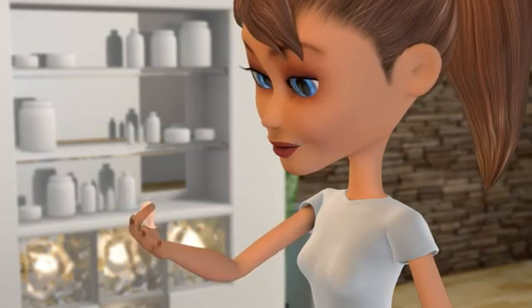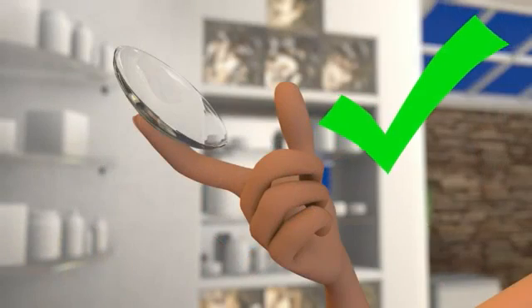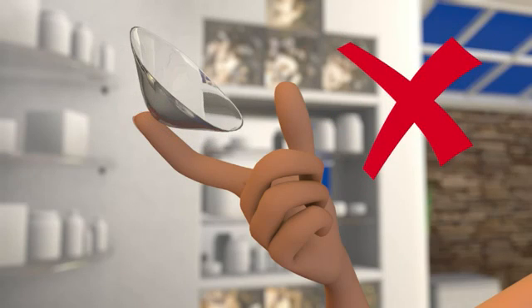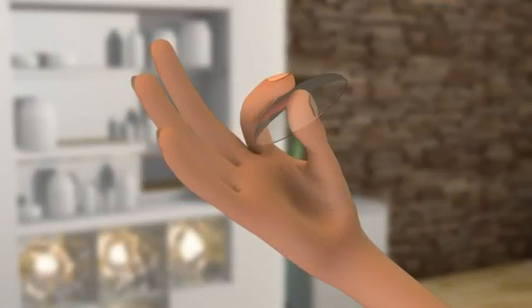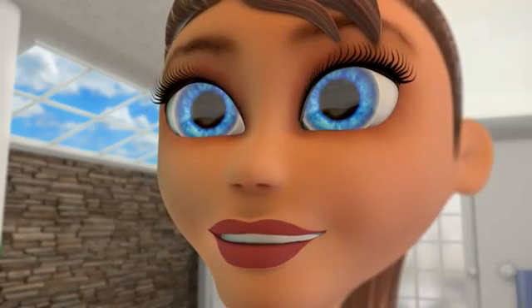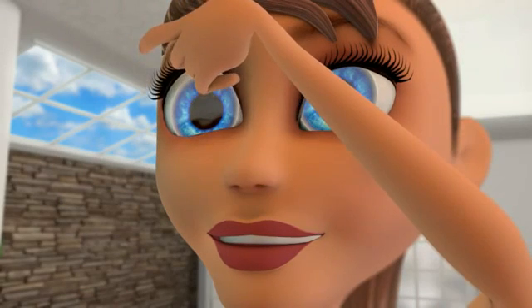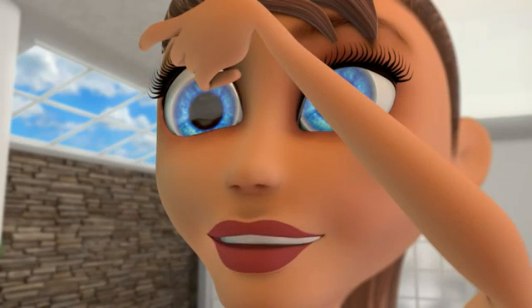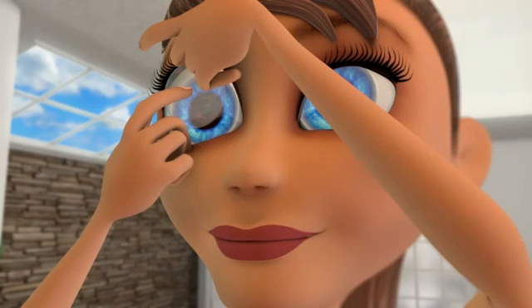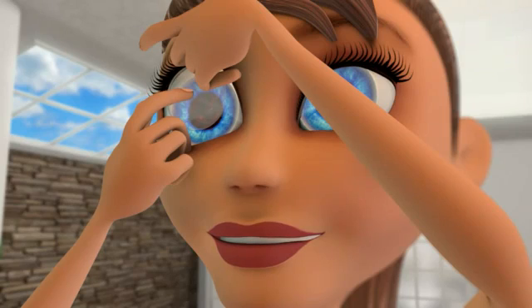Then, verify that the contact lens isn't inside out. There are two ways to determine if the lens is inside out: if the edges of the lens turn out, or if you pinch your contact between your thumb and forefinger and the edges turn out. If the lens is inside out, simply apply a few drops of contact lens solution and reverse the lens. Once the lens is correct, make sure your hands are dry and, using your other hand, hold your upper eyelid open so you won't blink. With the middle finger of the hand holding the lens, pull your lower eyelid down. Making sure not to blink, look straight ahead and place the contact lens on your eye.